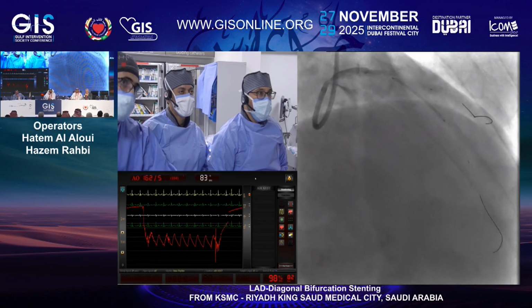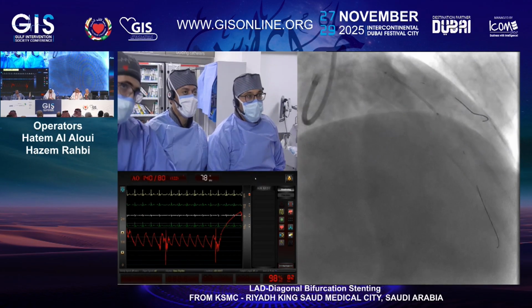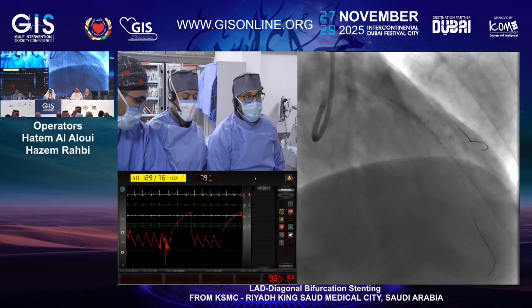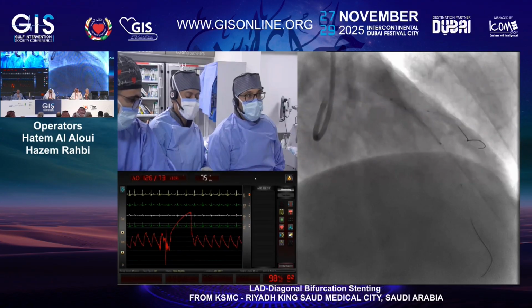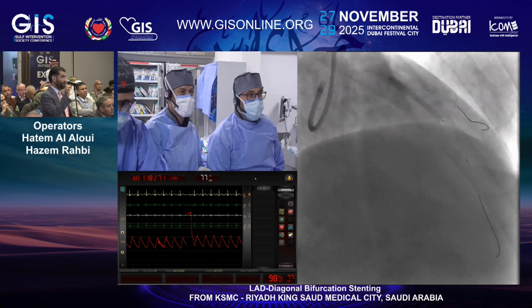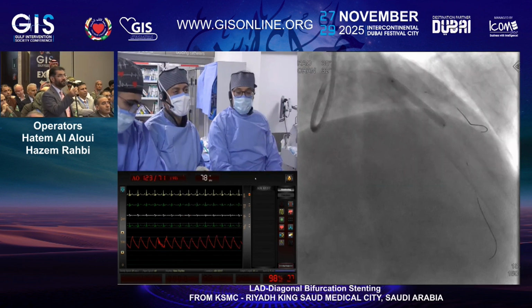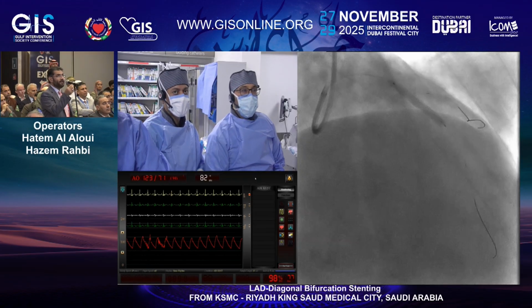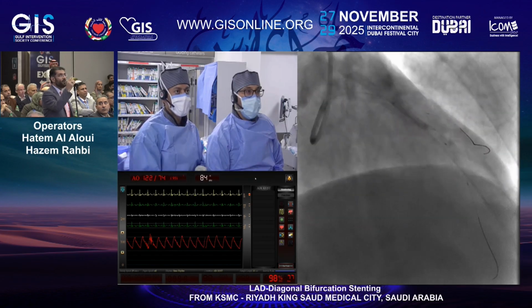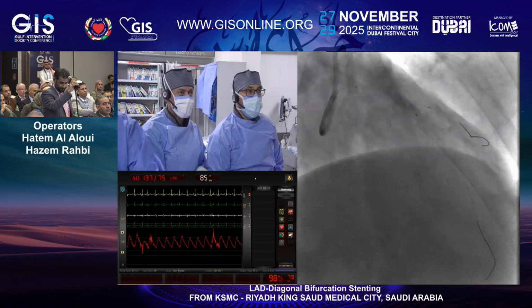Another question from the audience? Assalamu alaikum, Dr. Hatem, Dr. Hazem. Wa alaikum assalam. Well done. I am really a bit against DCB. Okay, Dr. Abdullah Shihab, go ahead, your opinion. You can see from this, I have a good experience in DCB. There is significant recoil of the vessels after DCB and cutting balloon. So I would really prefer to stent, even to secure the diagonal because it caused some ST changes. I would really go for a two-stent strategy rather than one stent because there is some recoil in the diagonal as well. So it seems that DCB here is not a good choice.